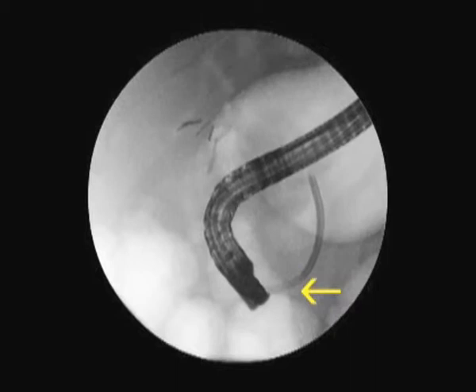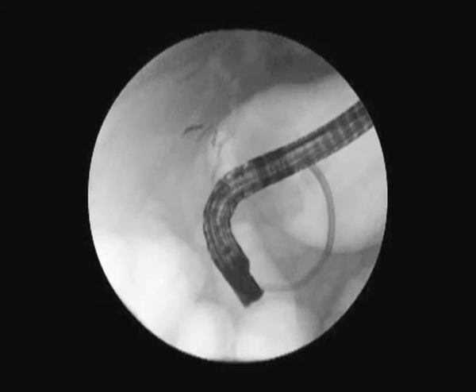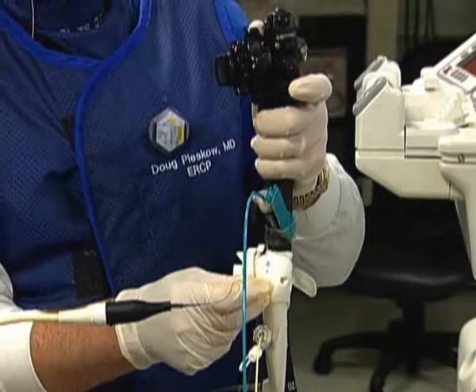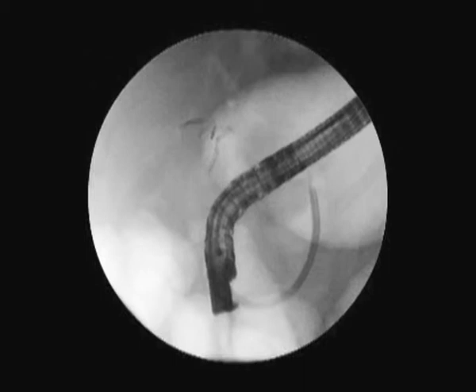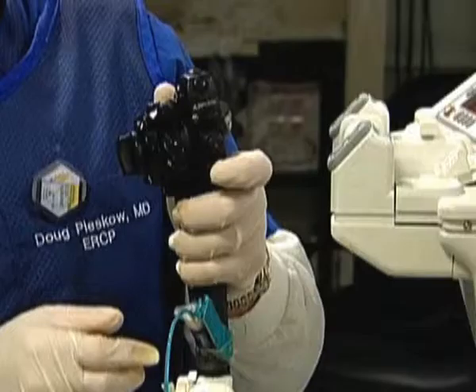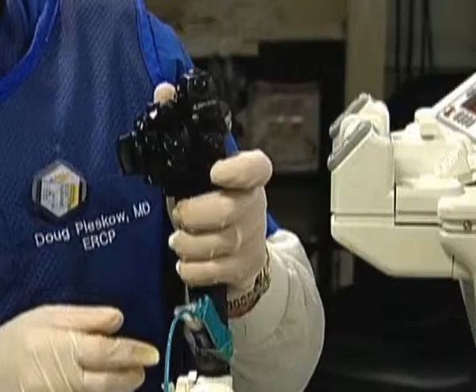You can see fluoroscopically where the EHL probe is. I'll advance a little bit more to get it into the straight part of the duct and it should slide right up. You can actually feel that and see it sliding up into the duct — there's the radiopaque marker advancing up. It should be almost at the tip of the spy scope, and there you can see it coming right next to our visualization probe. Now we're going to see this endoscopically on the spy image at the 10 o'clock side. Jermaine is now infusing some saline into the duct.